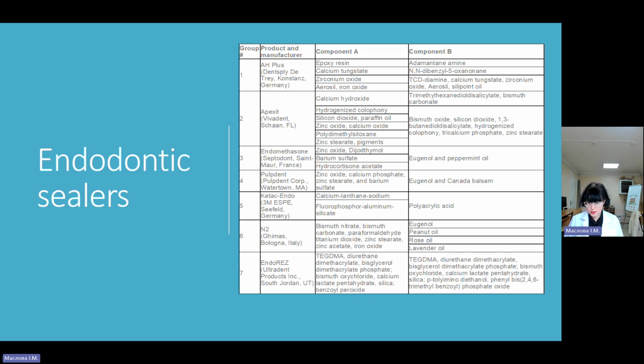Glass ionomer sealers. Glass ionomer sealers were developed as restorative materials. They offered the potential to bond to dentine by chemical bonding, suggesting a leak-free root filling might be achievable. Initial research on their endodontic use showed greater dye leakage compared, for example, to AH26.